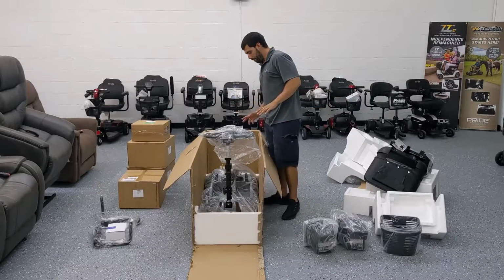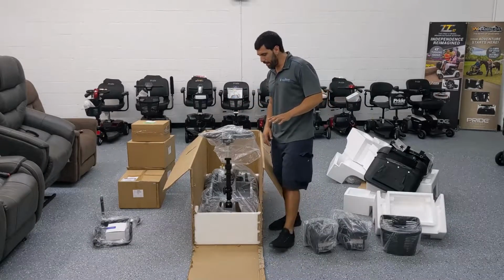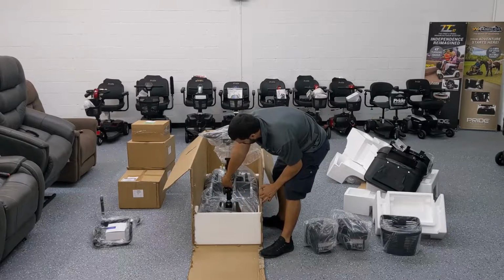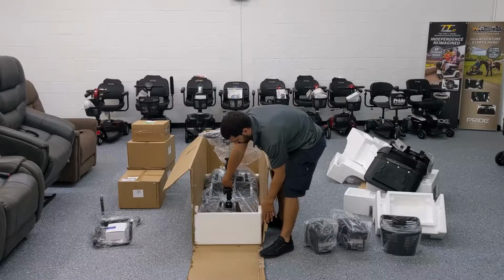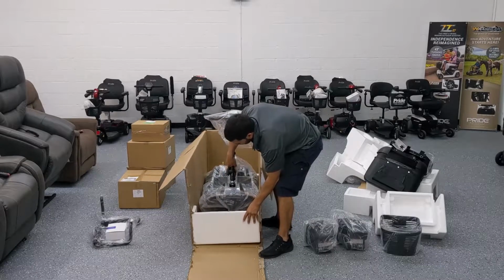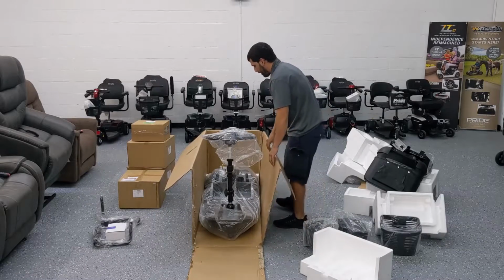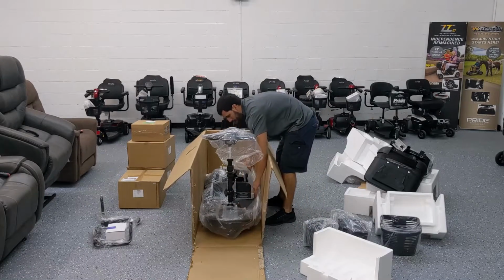So the last step is going to be, you might need help. This piece of styrofoam needs to come out of the way. And the way I do it, you may not have the strength, you may need an extra person, but I pick this up, put it back down. Okay, so now at this point, it's ready to roll out.